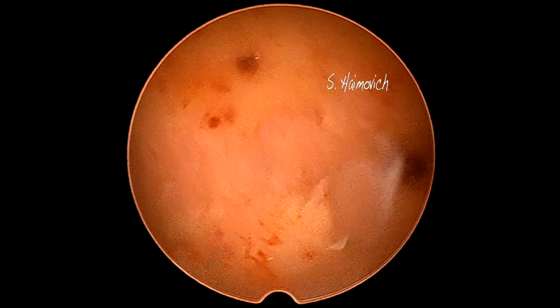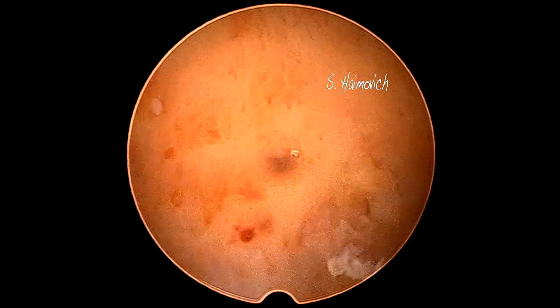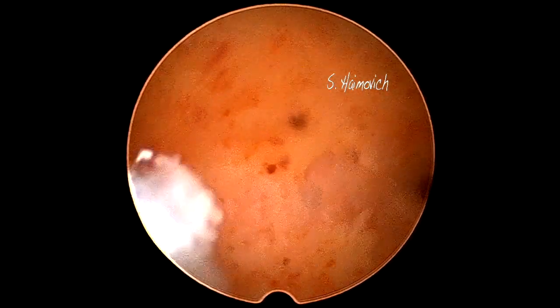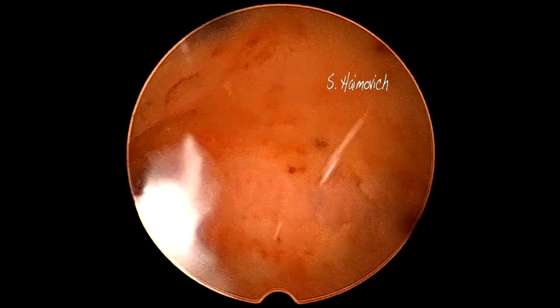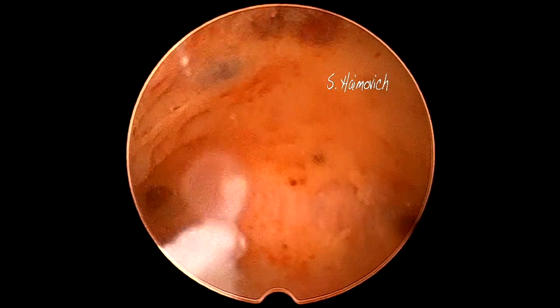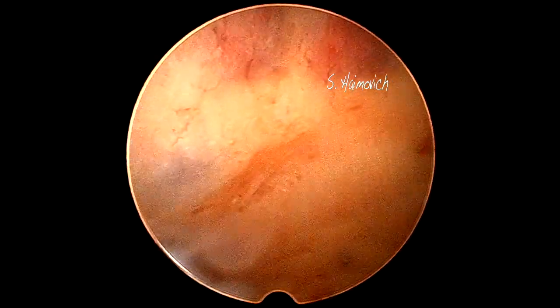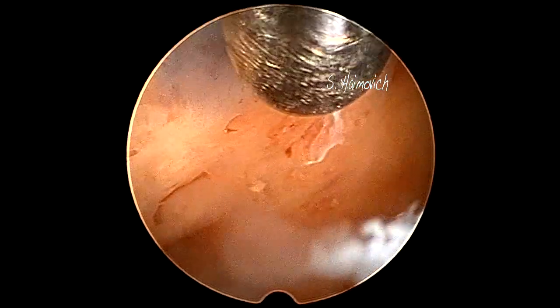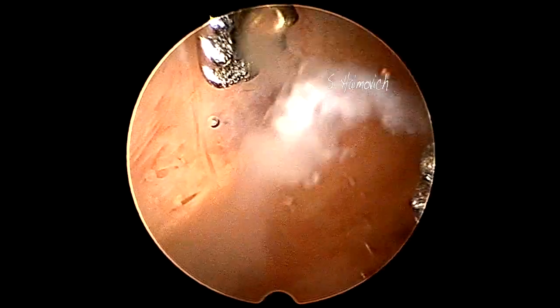We look for any anomaly such as signs of inflammation, adenomyosis, etc. Look at this cavity — what do you think about the endometrium in this case? We can see dark blue or brown spots suspicious of adenomyosis.